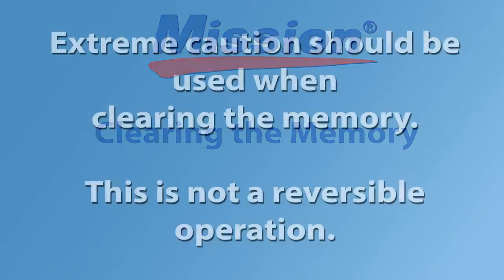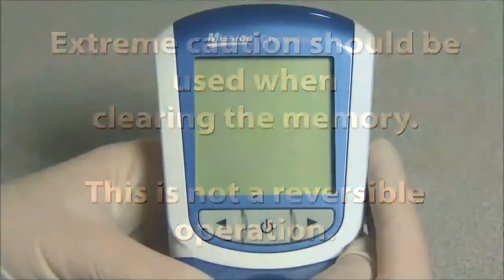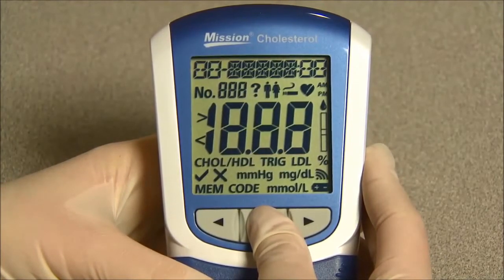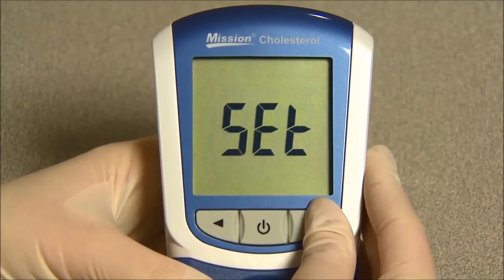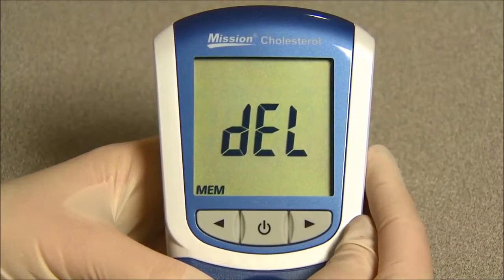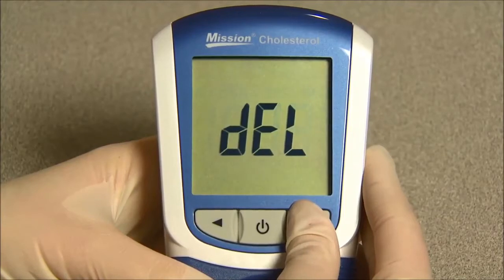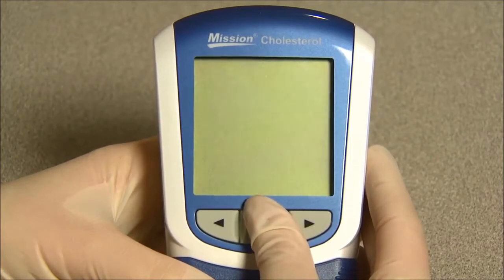Clearing the memory. Extreme caution should be used when clearing the memory — this is not a reversible operation. To delete all data from the meter database, enter the setup menu. Press right or left until DEL is displayed, then press the power button to enable data deletion. MEM will be displayed. Press the power button to delete all the data in memory, then the meter returns to the setup menu. Press right or left until ELT is displayed and press the power button to exit the setup menu. Press the power button to turn off the meter.